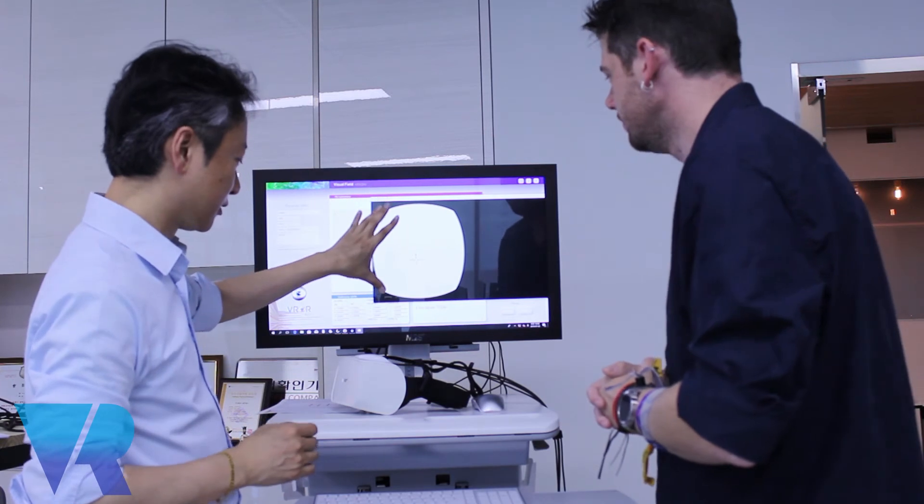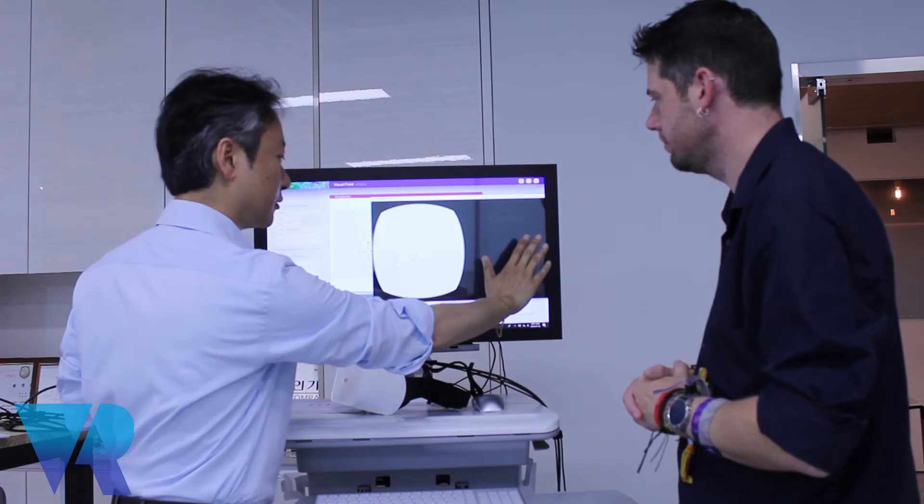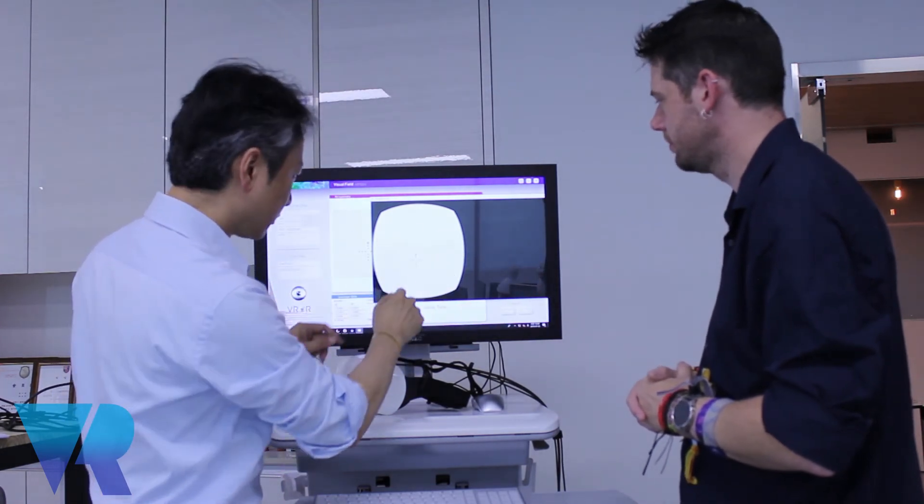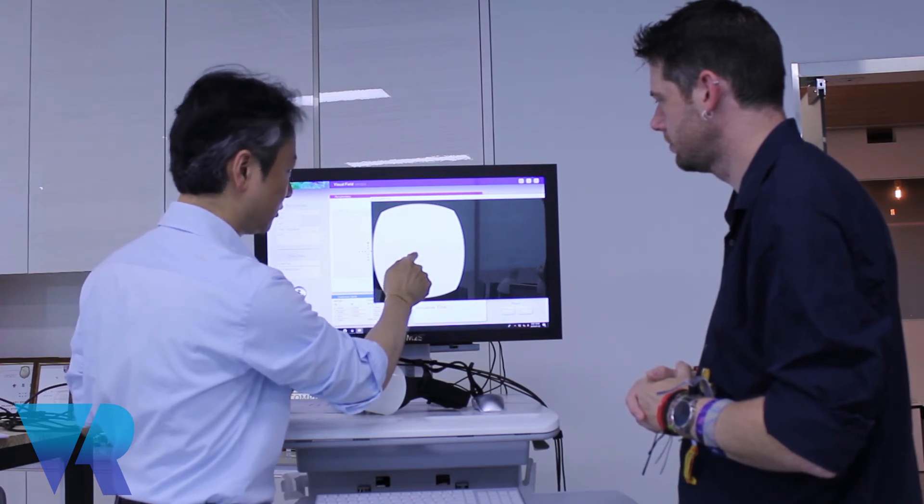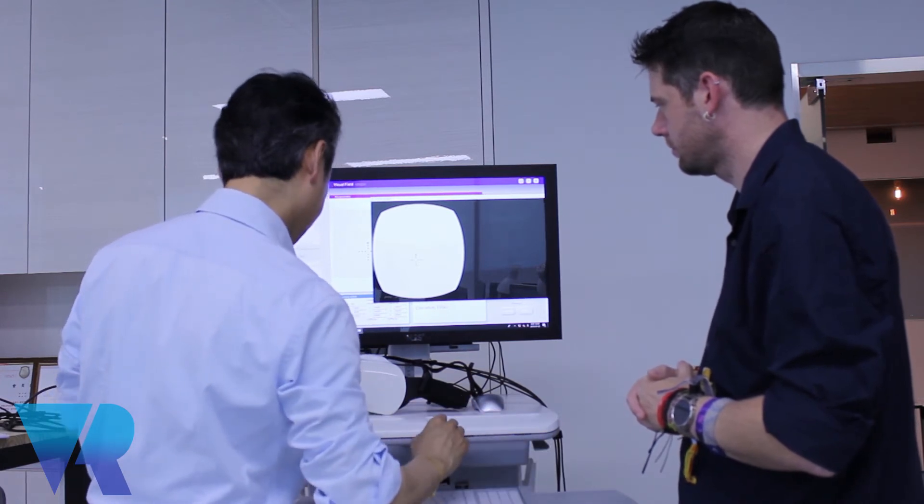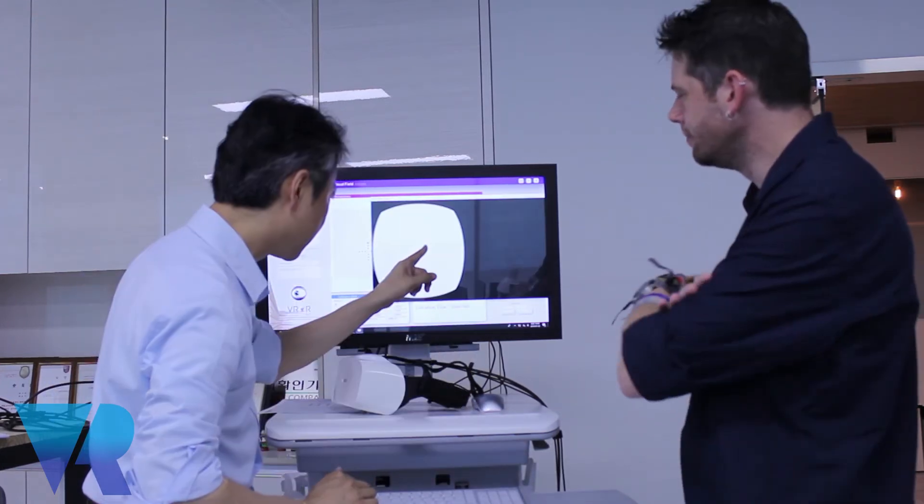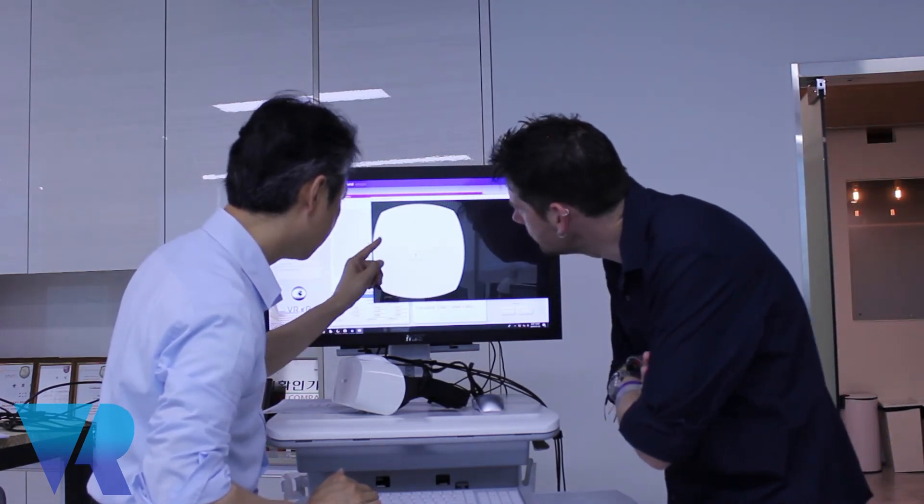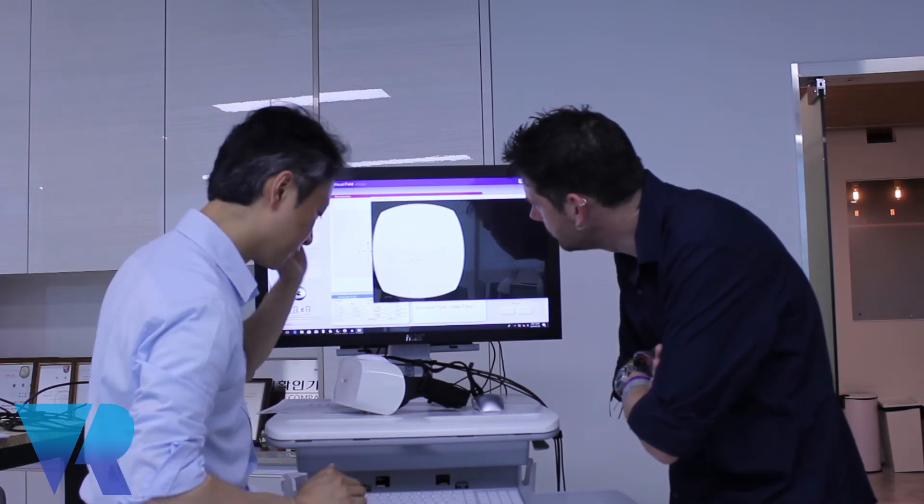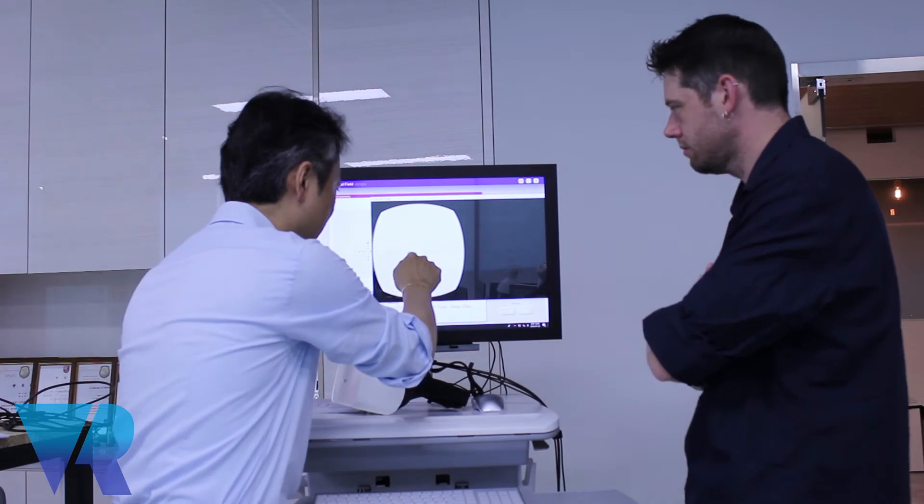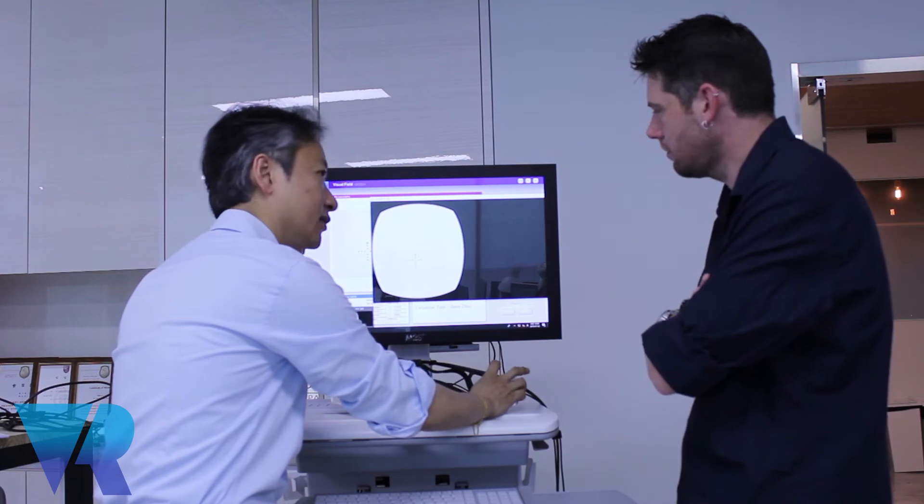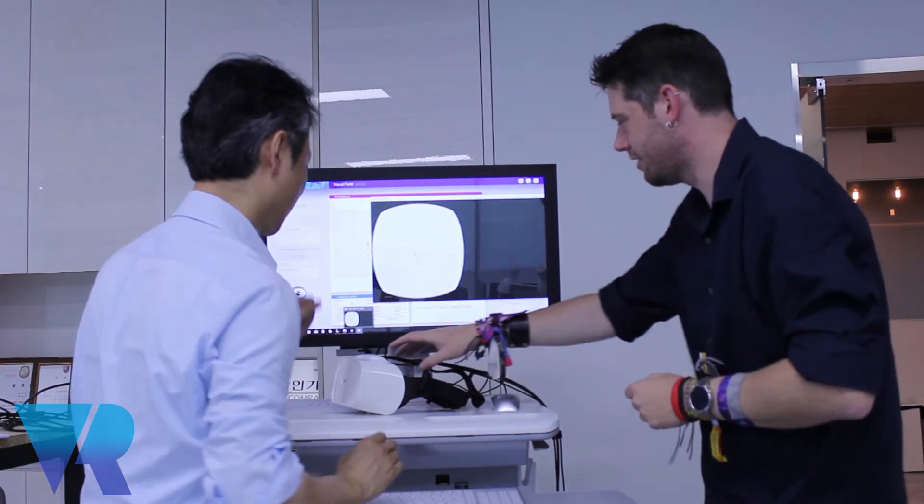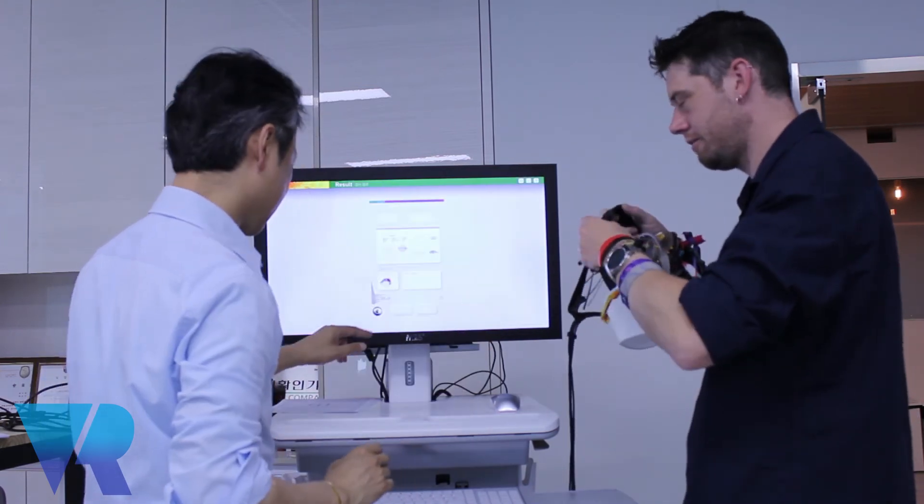Basically on the screen, the right side will be dark only for the left eye test. The patient, you, will take a look at this yellow dot all the time. When we run the test, if you see this small white dot coming out, then you click it. So you click it whenever you see the white dot essentially. Exactly. Would you prefer left eye or right eye?